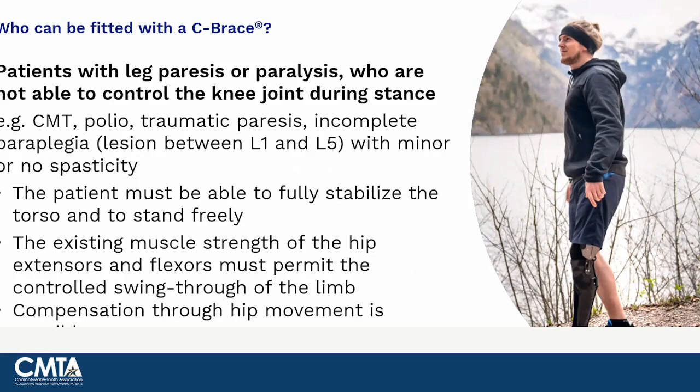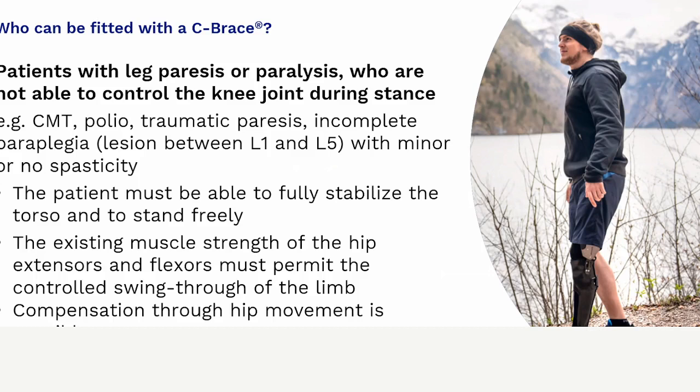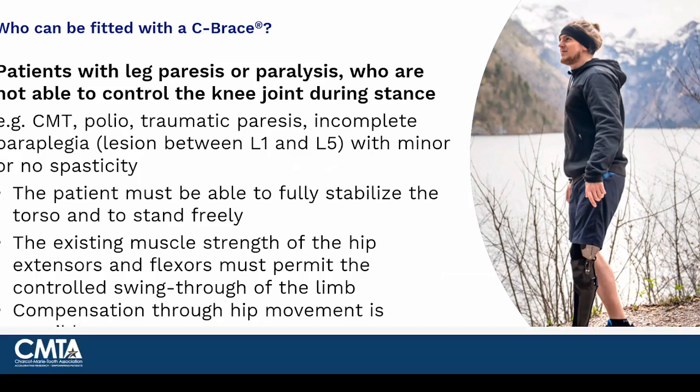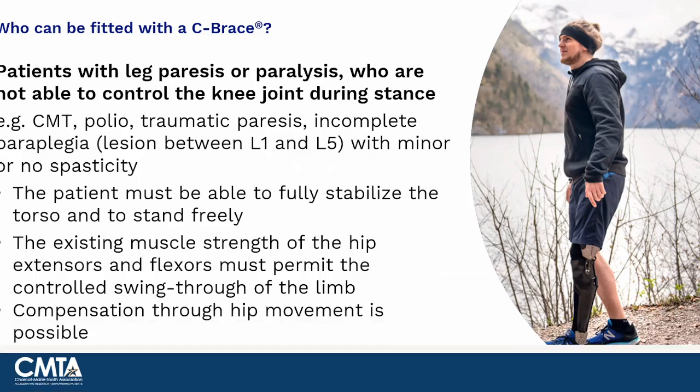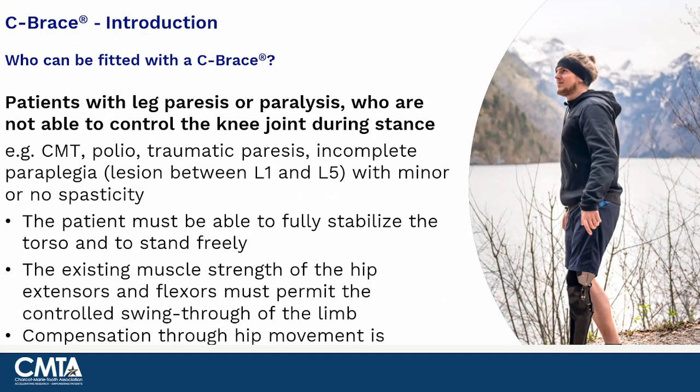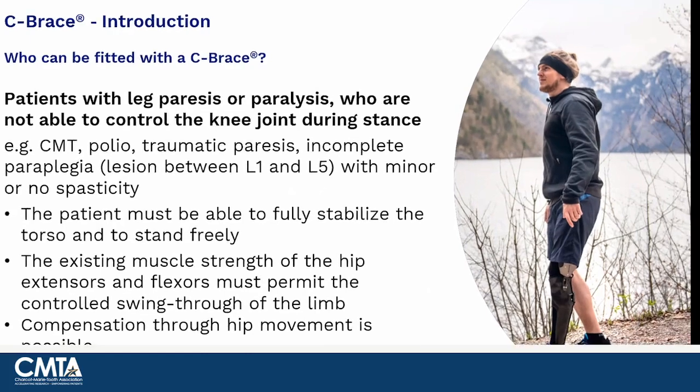So who is the C-Brace for? All right, so the C-Brace is for anyone who has leg paresis or paralysis. So anybody that has weakness in those thigh muscles, right? That's really where the C-Brace is going to provide the most difference for you. If you have weakness in your thigh muscles, it's really going to be able to provide some support for you. You do have to be able to stabilize your torso and stand up. But once you can do that, you really might be a candidate for a C-Brace. And you have to be able to advance your limbs forward. So that's another requirement. The C-Brace doesn't walk for you, but it does allow you to walk in a more physiologic or more natural manner.